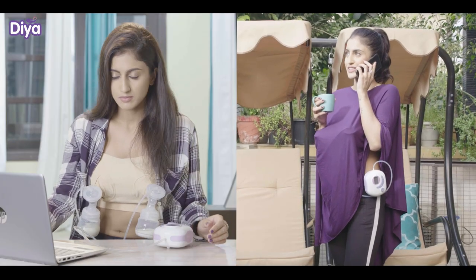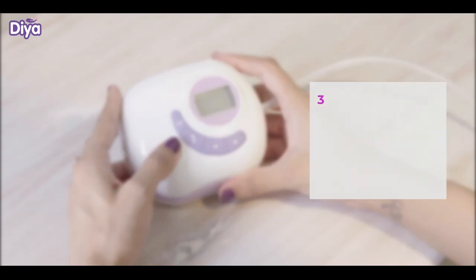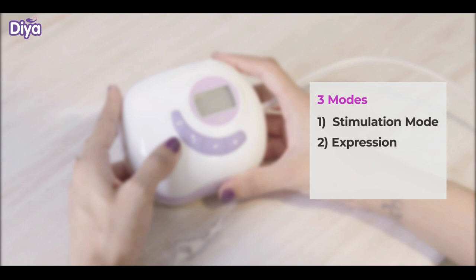You can sit or stand as per your preference. There are three modes: Stimulation mode, Expression mode, and Power Expression mode.